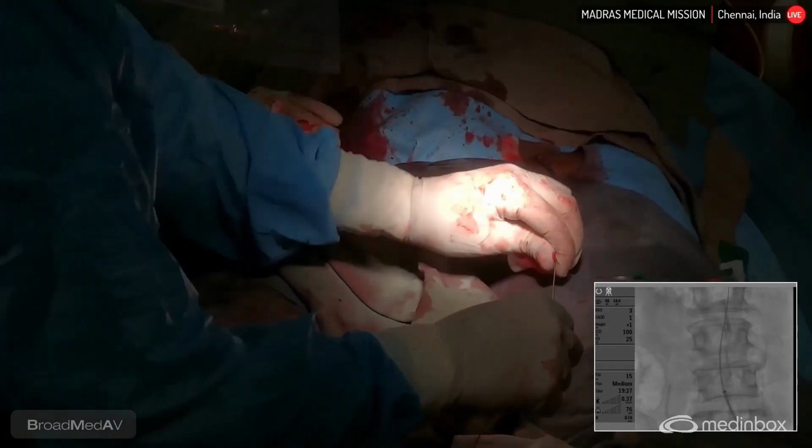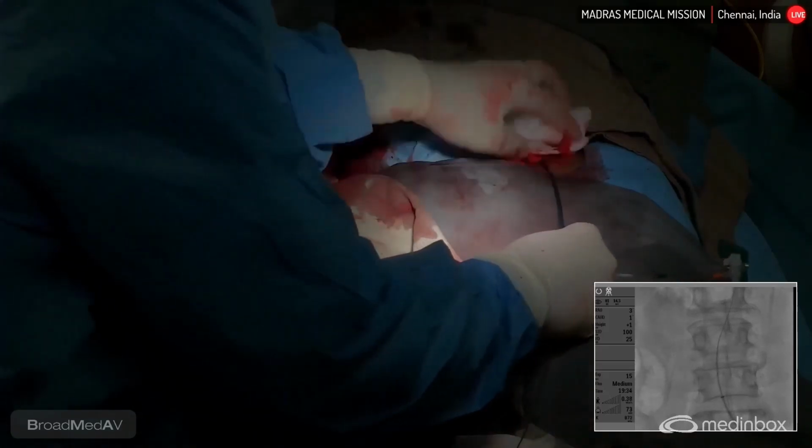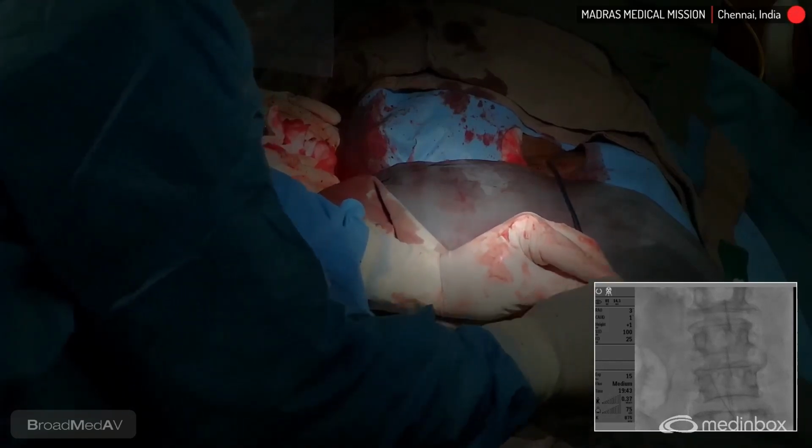Take the wire down. No, you have to go to the opposite side. Put a crossover sheath. Now go to the opposite side. This is a dilator. Remove the dilator. Come back. Pass the wire into the opposite side.